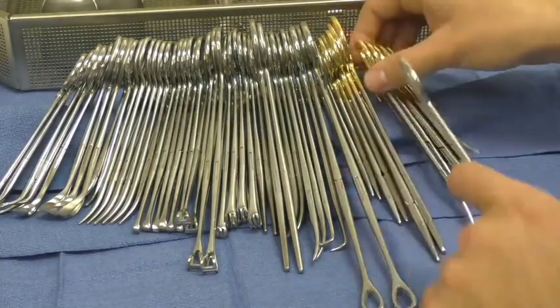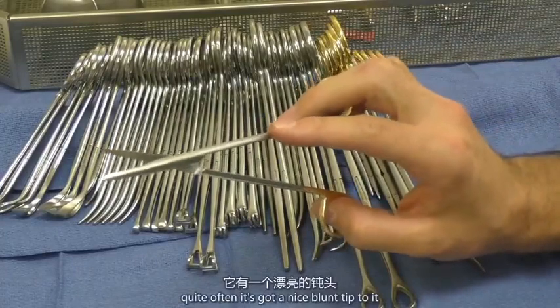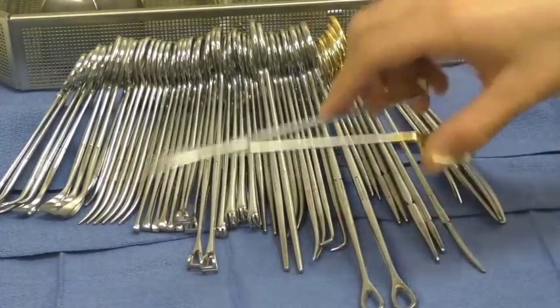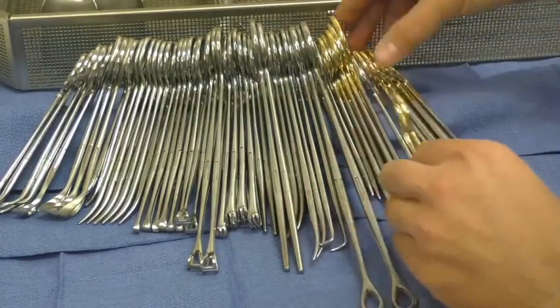That's a Potts Smith. Now we have the Metzenbaum scissor. This is a scissor that a general surgeon will use quite often. It's got a nice blunt tip to it, and they'll use this for dissection all the time. This will be your main tissue dissection scissor for general surgery.